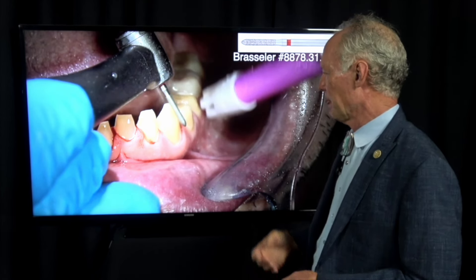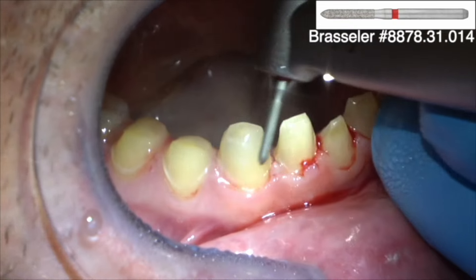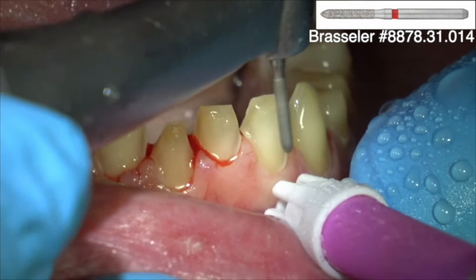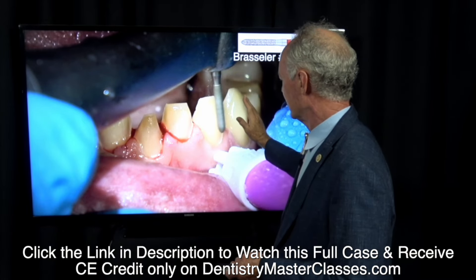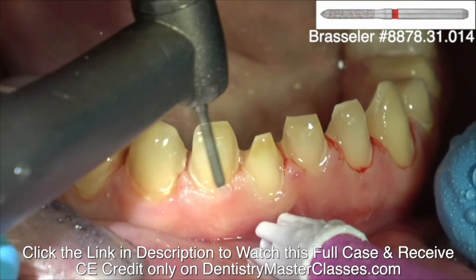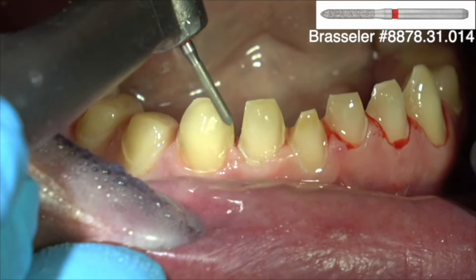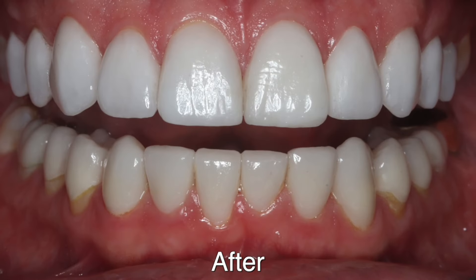You want at least a millimeter and a half, but I try to go with 2 millimeters just to be sure the technician has enough room for the restoration. Check again with the mirror — be sure there's enough incisal and facial reduction. Now remember, if the patient has a vertical overbite, you've got to be sure there's enough space on the facial of the teeth, not just the incisal. The incisal will be occluding with the palatal surface of the maxillary anterior teeth, as will the facial. So you've got to be sure there's enough reduction all the way down the facial surface of those mandibular anterior teeth. Just re-prepping, being sure everything draws. It gets kind of tight in between the teeth, so I'm going to prep in between the teeth with a flame-shaped diamond. That's the Dental Minute.